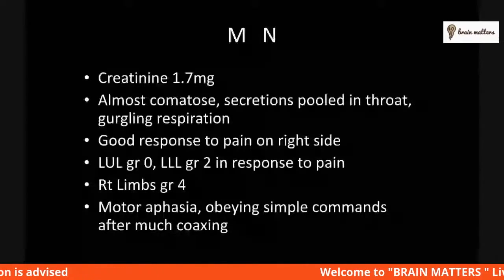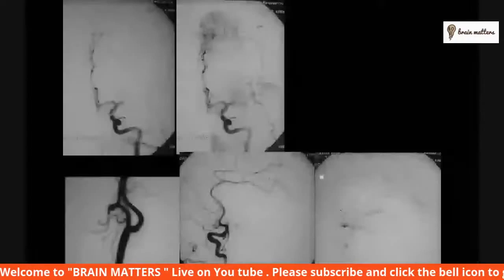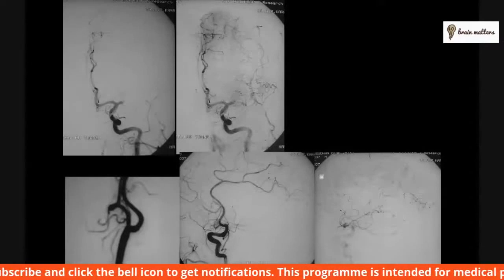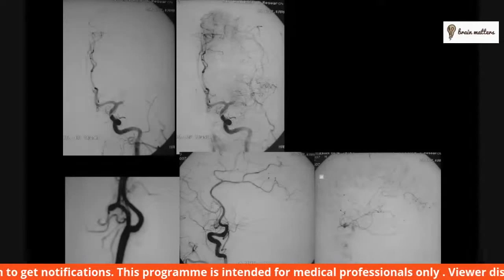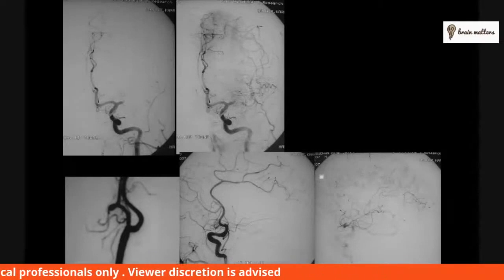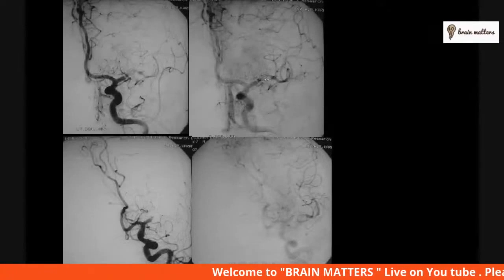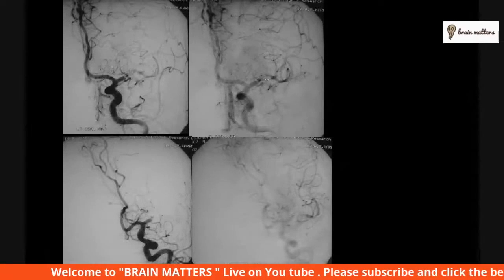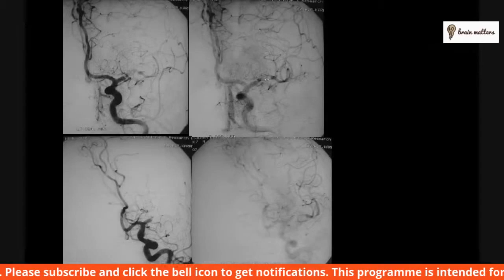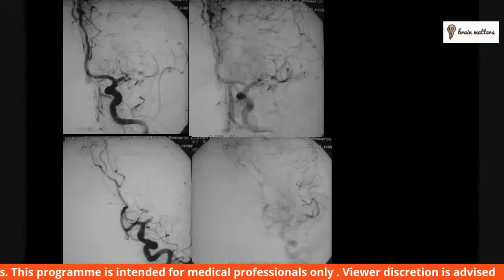And this was his angiogram, which showed total occlusion beyond that short stump of M1 and good retrograde flow from ACA to MCA via collateral circulation. And this was coming down almost to the perforators, almost to the point of occlusion. So on the bottom right film, you can see that the retrograde flow from the ACA to MCA is coming all the way down to the Sylvian fissure, almost to the point of occlusion. So the occlusion was a very short segment occlusion.